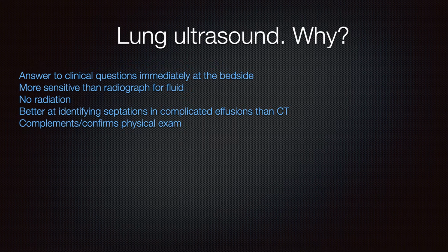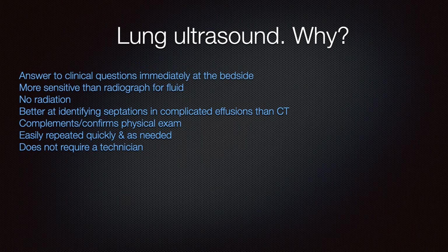And then it complements your physical exam, or often confirms suspicions you had from your physical exam for the patient, and can avoid further imaging at times. It's also easily repeated, can be done as needed, can be done daily, even multiple times a day, to follow a patient's clinical condition. It does not require a technician, like all POCUS features.